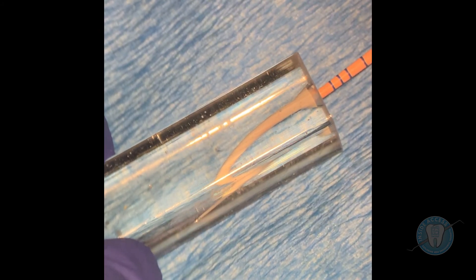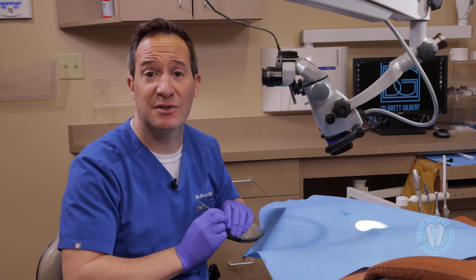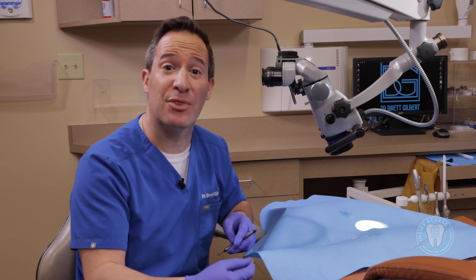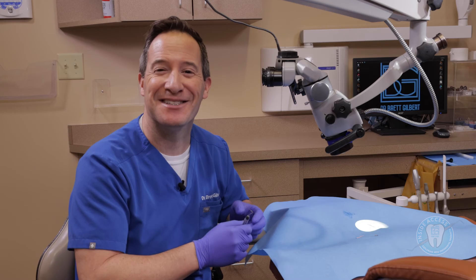You can then take varying depths depending on the clinician. A lot of doctors like to make a little inroad into the canal space, and what that allows you to do is bring a nice plugger into place and give some hydraulic condensation to make sure the sealer goes into all the little intricacies of the canal, getting a really nice homogenous fill. You can see the sealer is fully coating the gutta percha and creating a nice opportunity for the bioceramic sealer to move into all the intricacies of the canal space. Because it has very little to no shrinkage — Meta claims almost zero percent — and a setting time of three and a half hours, you literally create a seal inside the root very rapidly. It's bioceramic, so it's biocompatible and sets in the presence of moisture.